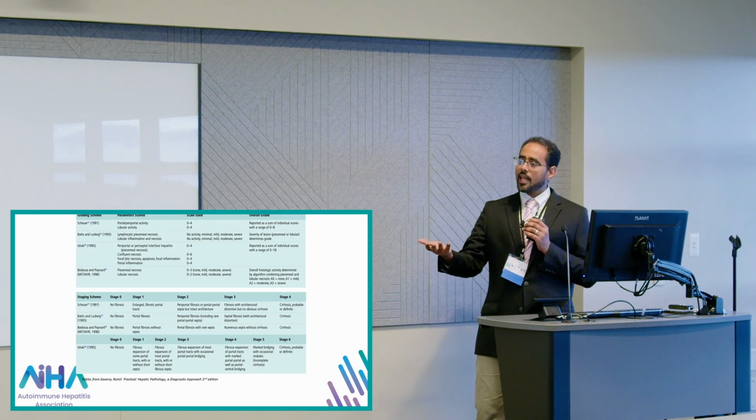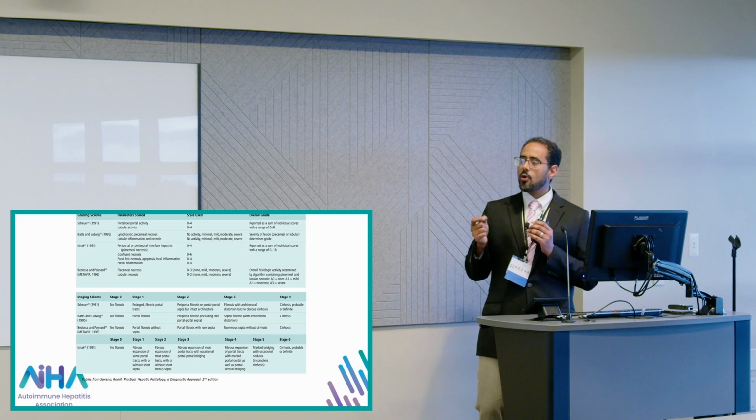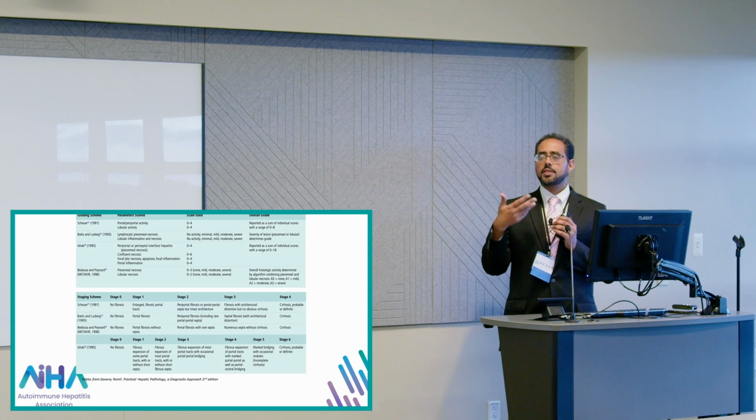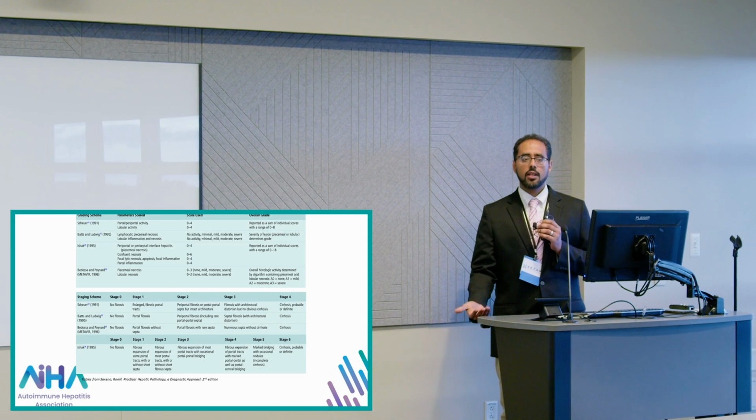I'm just showing you how complicated the process is of giving a score, a number, for how badly the liver is injured. I'm just going to give you the simple form of description that we tell most of our hepatologists in the report.